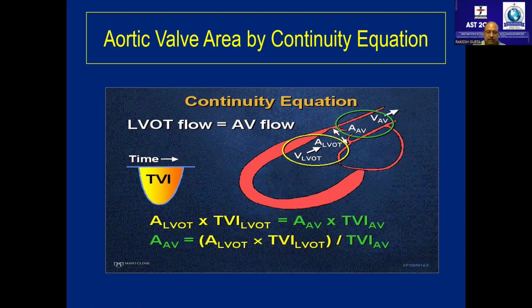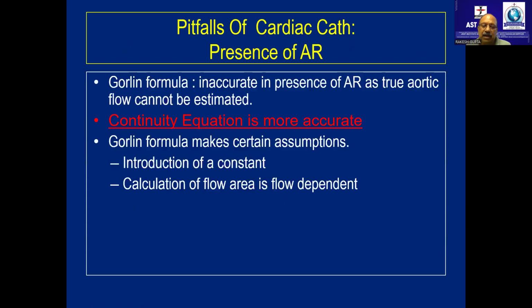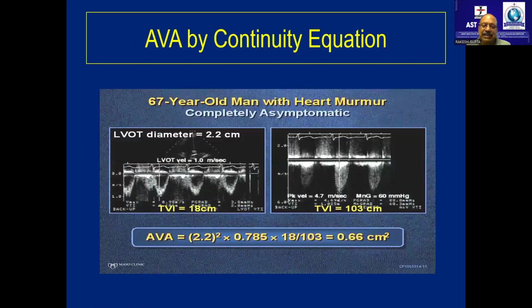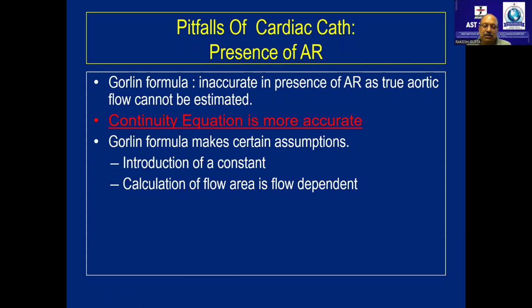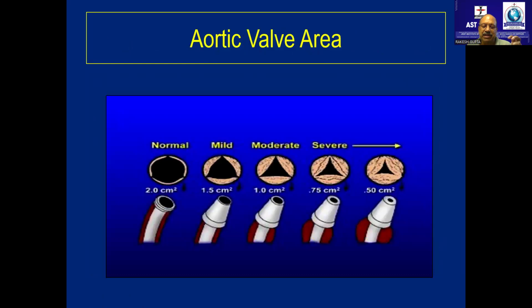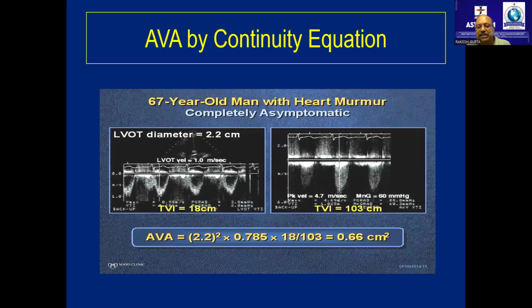Yes, sir. Clear, sir. But sir, I wanted to know, can you not get the area of aortic valve by taking the diameter of aortic valve? The answer is we do not have a good resolution. What exactly happened? You have a very good question, like we just go and do a planimetry, correct? By aortic valve area. But when we looked at transthoracic echo to look at that area with our calculation, it was not correlating well. What was correlating well was transesophageal area by planimetry.